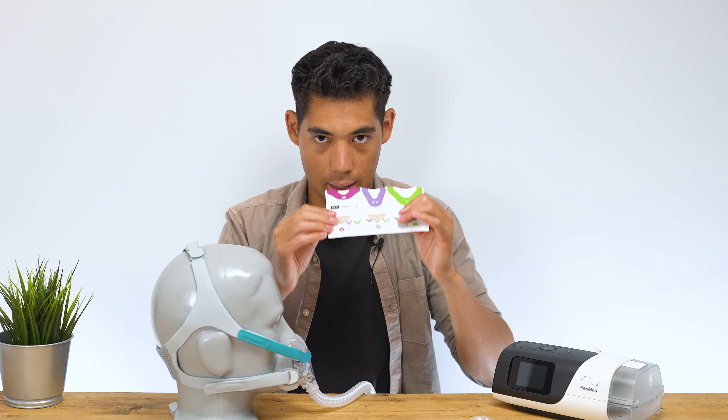You'll see other masks — like the Dreamwear mask, which is a hollow frame mask — where the frame sits quite at the front of your head, so you have a kind of yin-and-yang, opposite-tugging approach for a secure fit both on the back of the neck and top of the head. Here I feel like the strapping is a little far back, so it can slip or feel less secure. That said, it's still a very secure mask — it just could be tweaked a little.